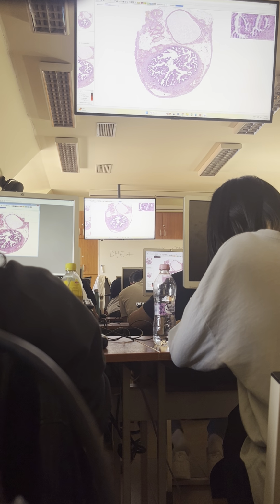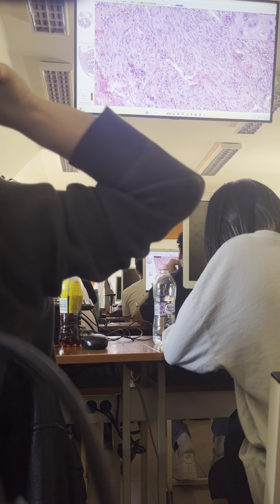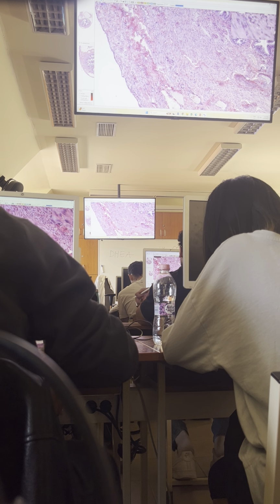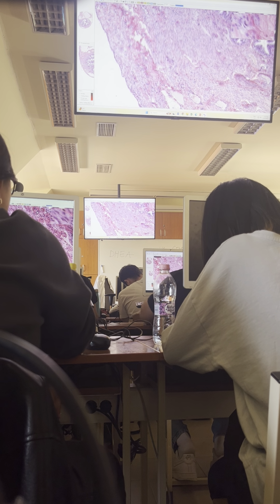so it's not so characteristic as the inner circular one, so it's difficult to demonstrate actually, but maybe in this territory you can see really cross-sectional profiles of smooth muscle cells, but you can see cross-sectional profiles of smooth muscle cells here as well. So these two sublayers are not very distinct, but usually consider that there is an inner circular and an outer longitudinal sublayer here.